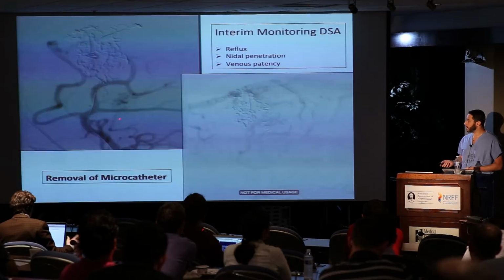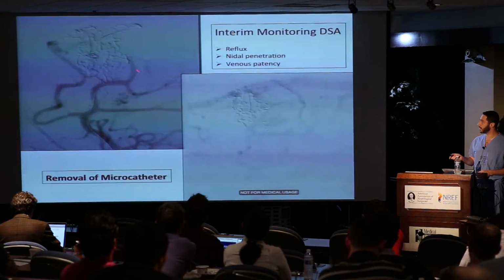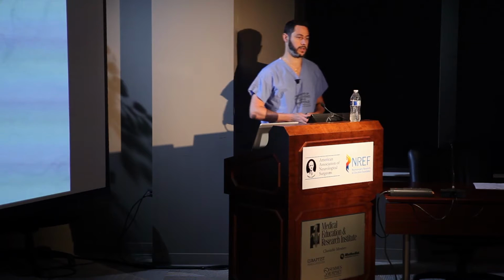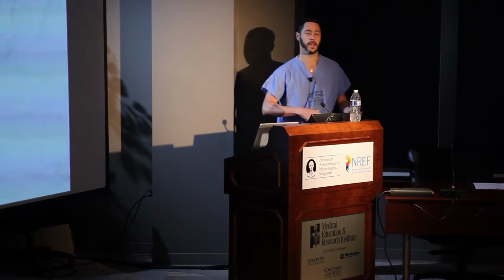So, we're in our last pedicle, this embolization. I pulled 2 marathons from this pedicle. Had another one here. 40 minutes. It's going on forever. We're pulling, we're letting go of the tension. If you guys have seen this, we're pulling, we're letting go of the tension. And it took a while.